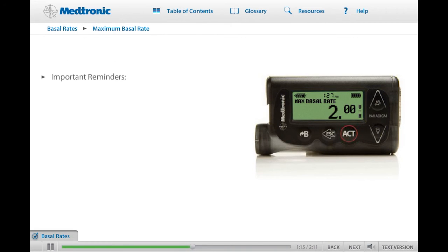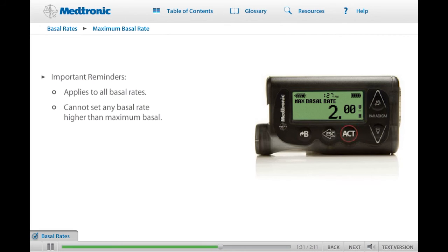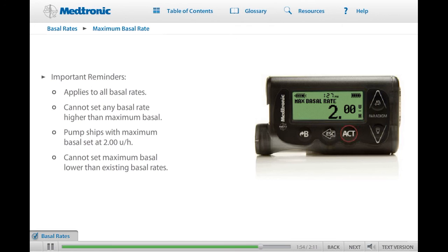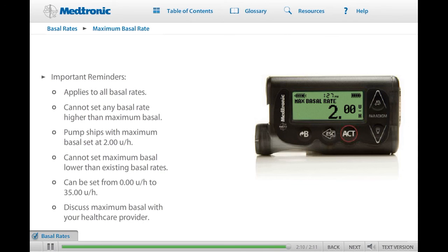Here are some important reminders about the maximum basal rate feature. The maximum basal rate applies to all basal rates, including temporary basal rates — you cannot set any basal rate to deliver at a higher amount than the maximum basal rate limit you have set. Your pump comes from the factory with the maximum basal rate set at 2 units per hour. If you have basal rates programmed and want to lower the max basal, you will need to lower the basal rates first, then change the max basal to a lower amount. The max basal rate can be set from 0 units per hour up to 35.0 units per hour. Discuss with your health care provider what your maximum basal rate limit should be.